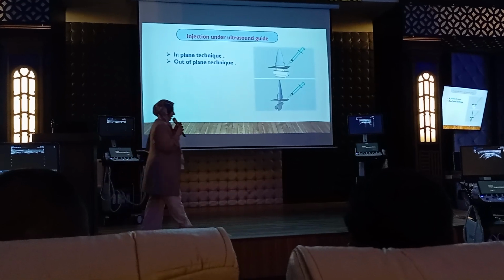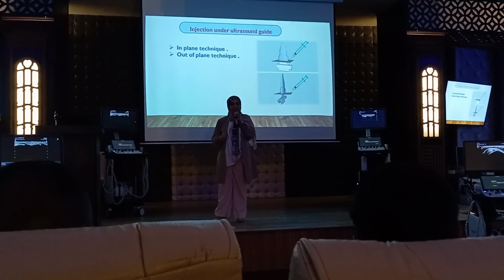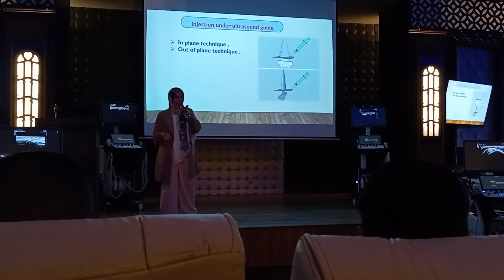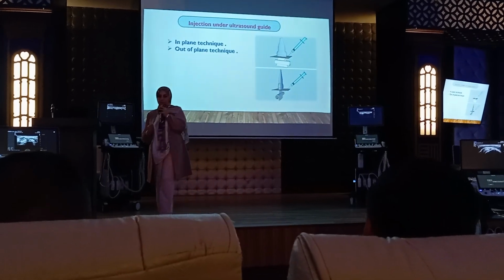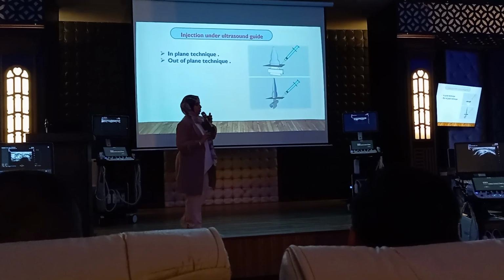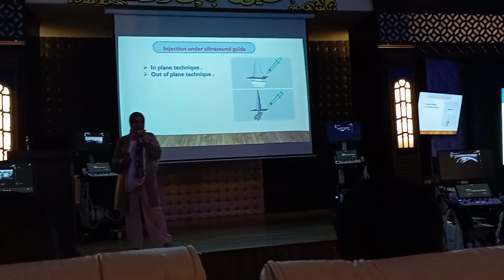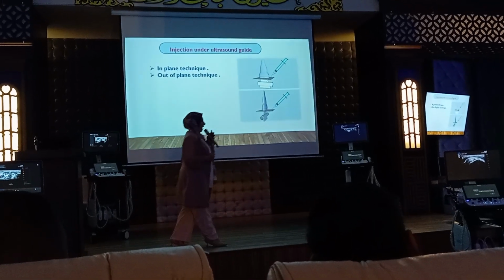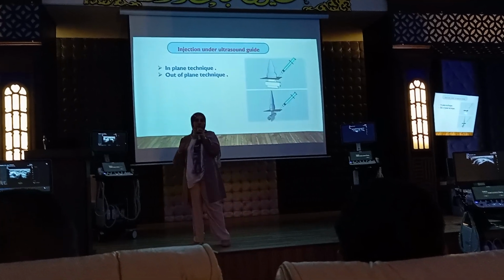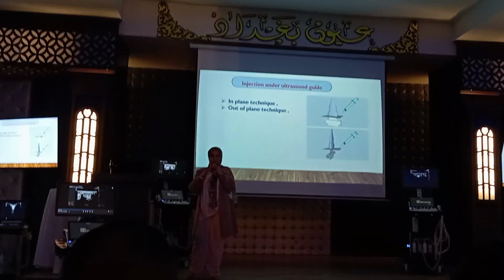Now, how to do injection? Whether it is a normal injection or whether to do ablation by radiofrequency. If we do, for example, steroid or PRP or local anesthetic, we have to approach either with an in-plane technique or an out-of-plane technique. But we prefer in pain management the in-plane technique for many reasons. Number one, we can see the whole length of the needle when it passes, in order to avoid vascular injury, muscle tear, nerve injury, and else.